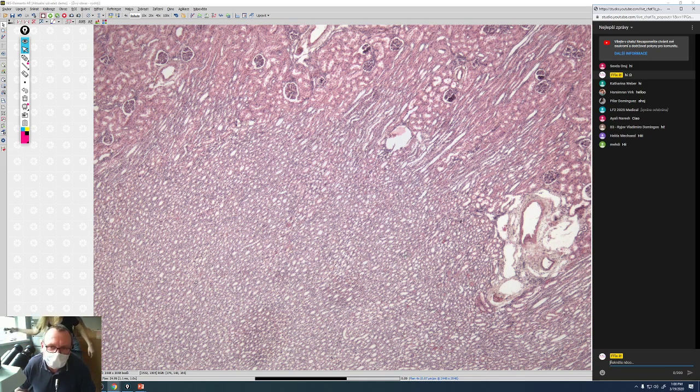We are planning to demonstrate all slides of the urinary system, with the electron micrographs which belong to this system. At the end there will be an embryological part, so according to my estimate, because it was on Monday in Czech, it can be about 4 hours of this video streaming.